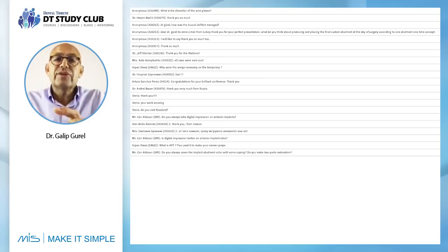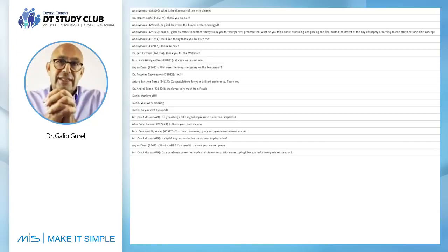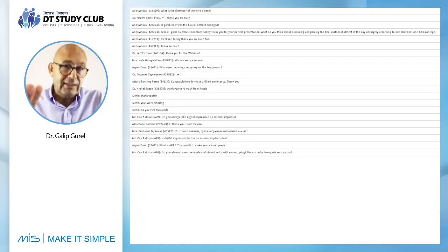You still do your customized abutment, but then you use it as a Maryland bridge, which will only stay there aesthetically. However, if you are going to load your implant, then you have to empty the inside of the pontic, right?